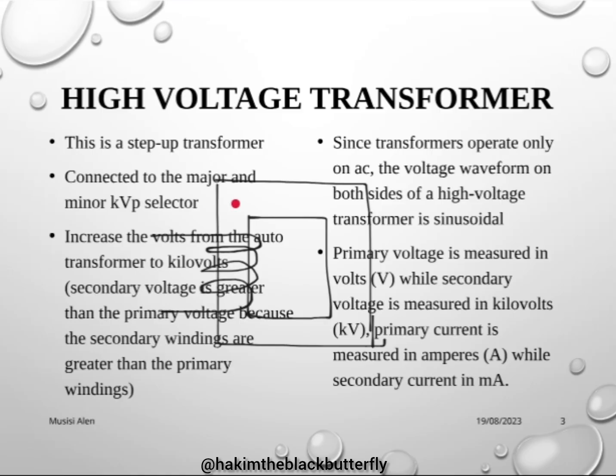If you have few windings in the primary and many windings in the secondary, so if you look at it well, you realize that we have few in the primary and many windings in the secondary. So this is a step-up transformer.